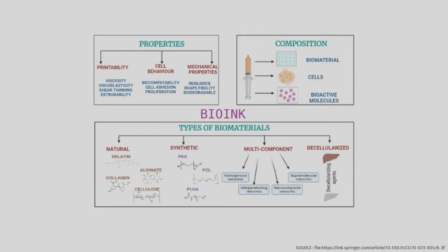Now, second, when you're adding cells into it, right? How is the cell behavior in the bioink? Now, whether it is biocompatible or not, whether there's cell adhesion happening or not, whether there's proliferation of the cells happening or not, those all will be catered to by the biomaterial that you're using along with the cells in the bioink. So these are the very important points that you need to remember while you are making your bioink.